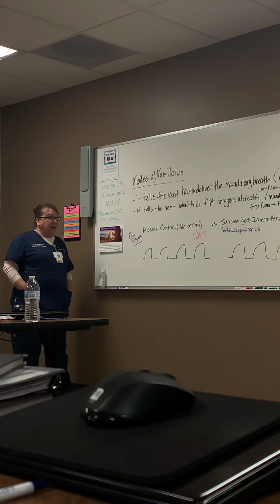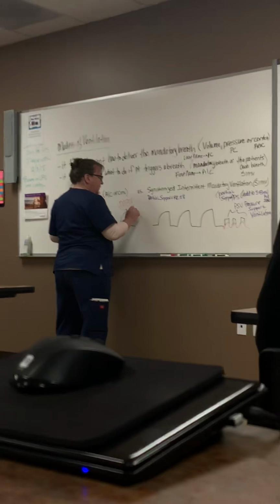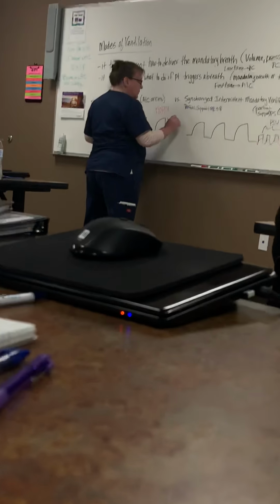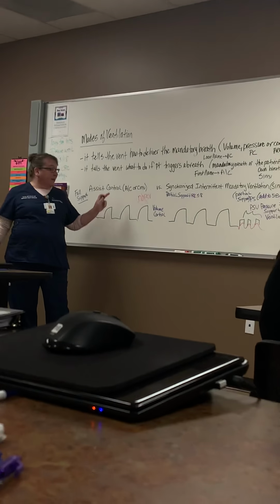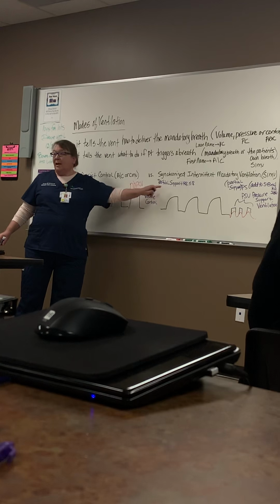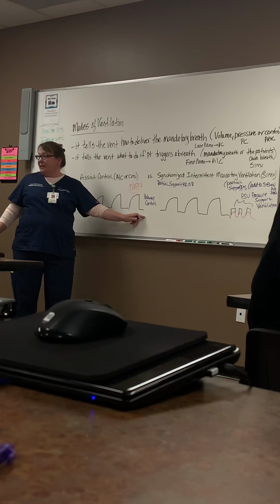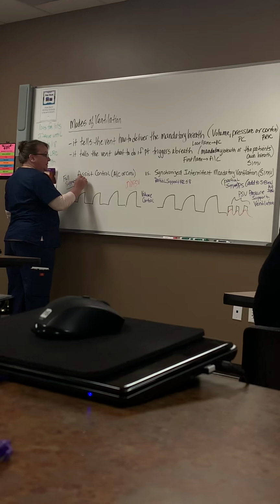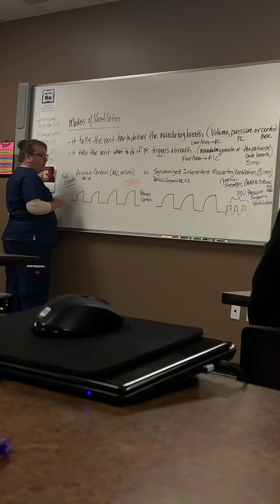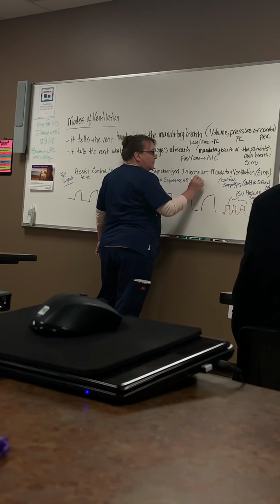Okay, so let's add in the concept of volume control. So now we're gonna say, we got AC, so volume control. Based on what we've been talking about, we can have AC volume control, and SIMV volume control, right? So that's gonna be our AC-VC and our SIMV-VC, all these terms that are gonna now start to make sense. So this over here would be AC-VC, now that we know what all those crazy initials mean. And this over here would be SIMV-VC.